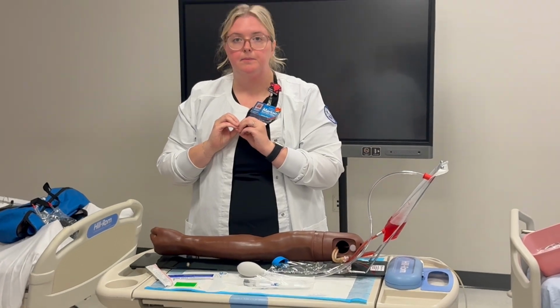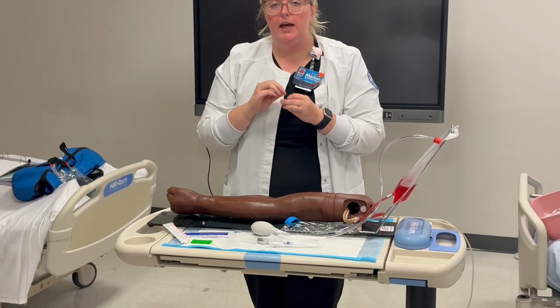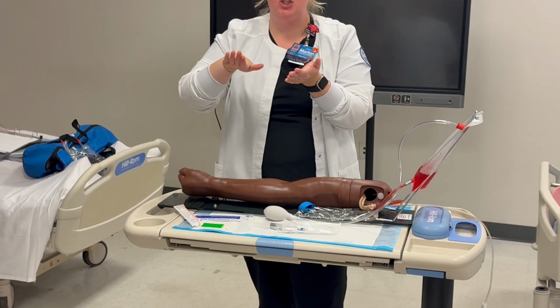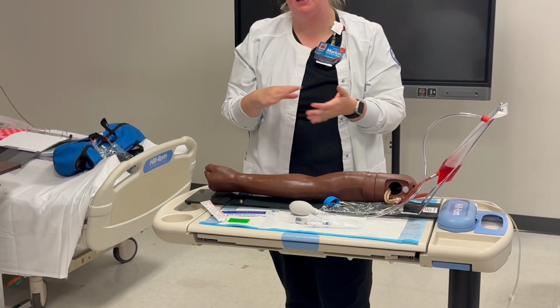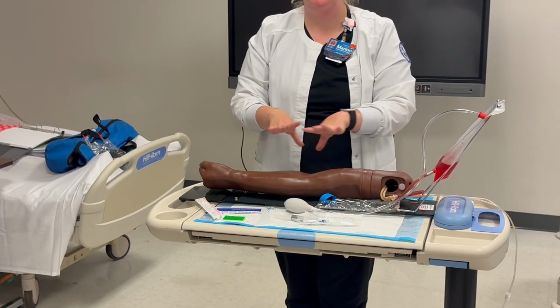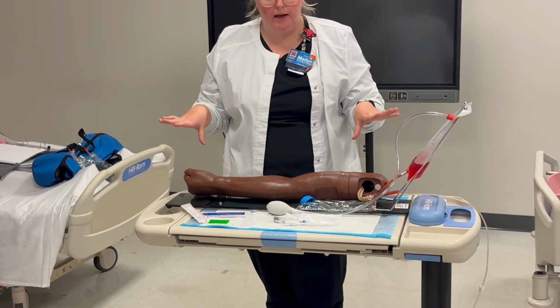So you let water drip out from that? Yes. In real life, they come in different packaging typically, where it almost is kind of like a bowl and it sits in there. But yes, if you'll have a towel under your patient, it's just normal saline, so it can leak a little bit, okay?